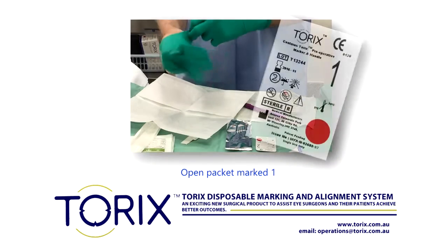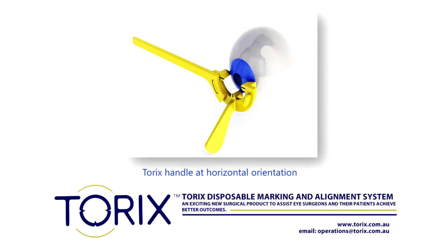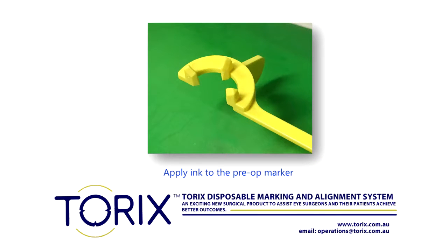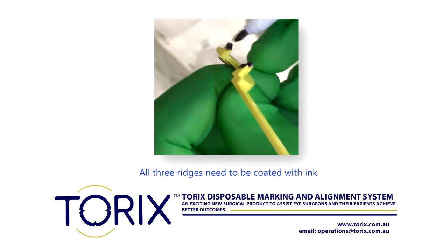At a sterile workbench using sterile gloves, open the packet marked 1. Next, pick up the handle and attach the handle with a horizontal orientation so it is ready to mark the cornea of the patient. Using a sterile gentian violet pen, generously apply ink to the under ridges of the pre-operative marker. All three ridges need to be coated with ink.